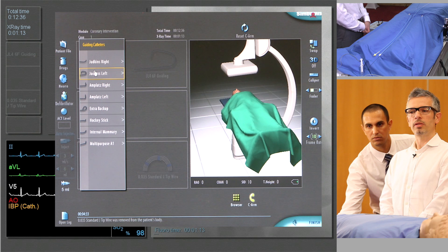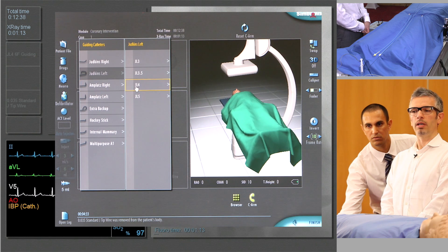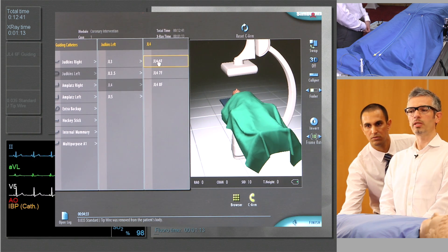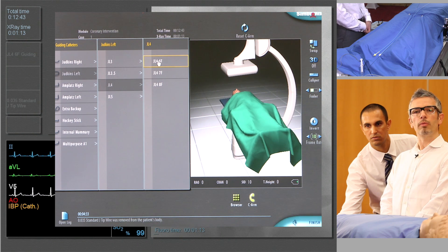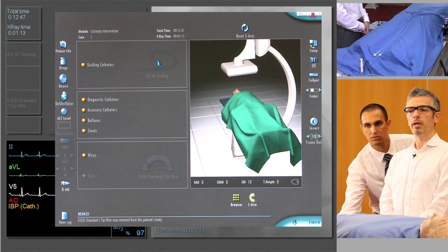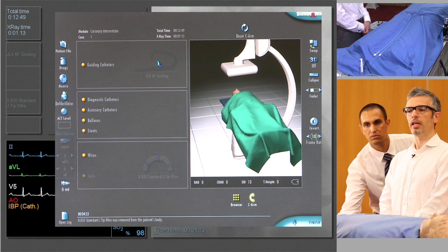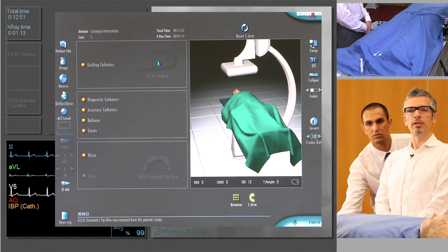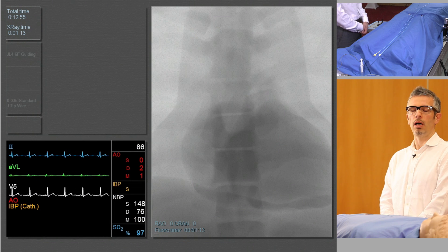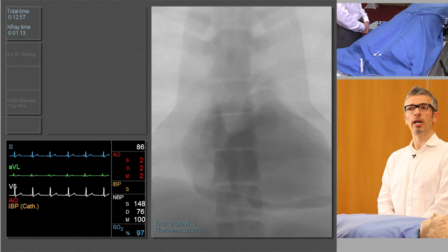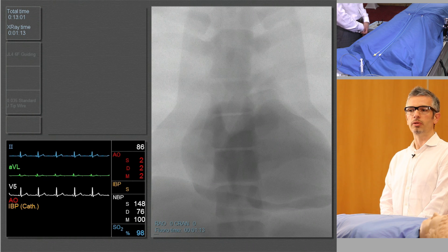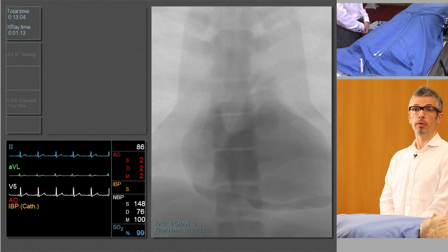The guide catheter that we're going to select is a Judkins Left 4. This has a 4 centimeter curve which, when coming from the femoral artery, is the typical size curve required to selectively engage the left main in the majority of patients. More elderly patients, those with hypertension, or larger patients may need a slightly larger guide catheter, and conversely those with a smaller aortic root may need a Judkins Left 3.5.